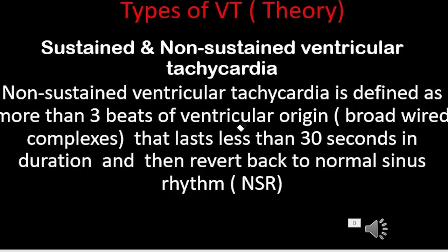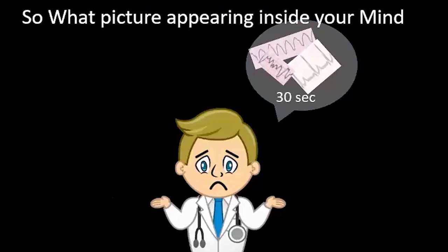The tachycardia, if you try to understand it merely by theory as shown in the slide, will not give you any clarity. So what picture appears inside your mind? Now let us try to understand with visualization in a conceptual manner.